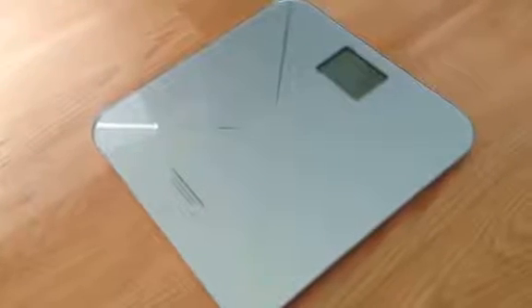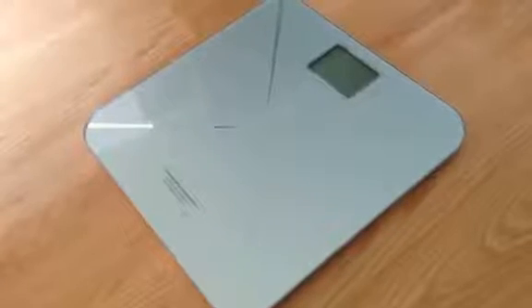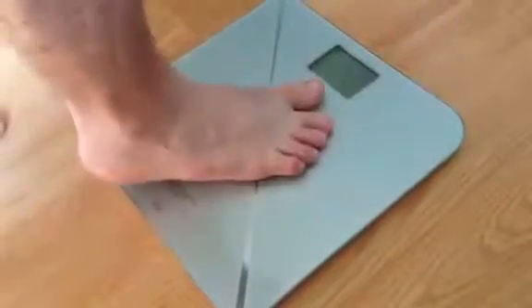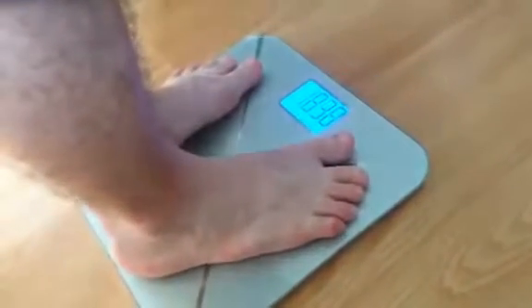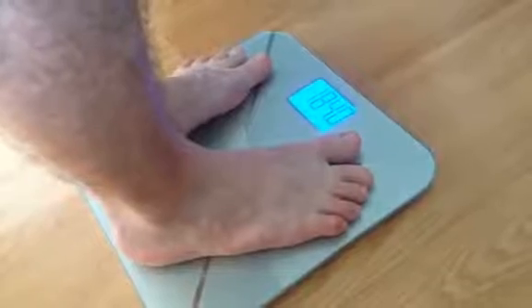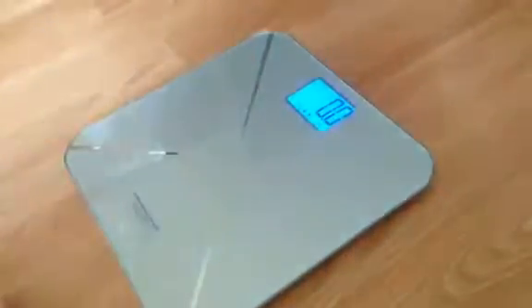We have it on the tare feature right now, so we're going to test it out and show you how that works. We'll step on it to get it going. It's zeroed out, and my son steps on it — it shows he weighs 184 pounds. He gets off and it's zeroed out again.